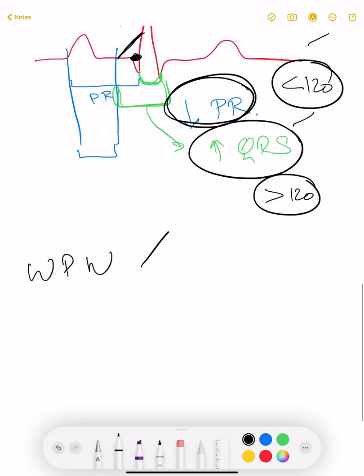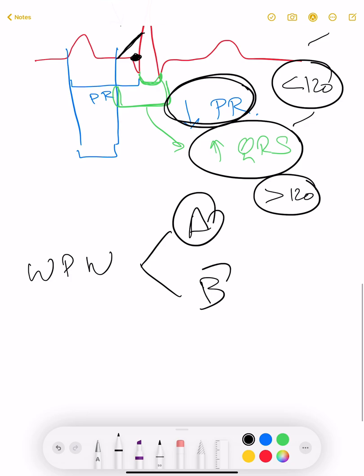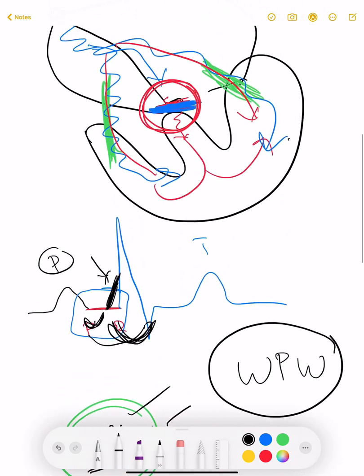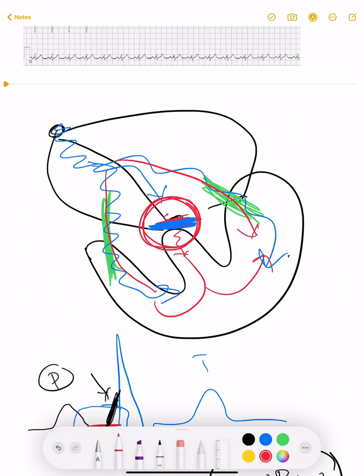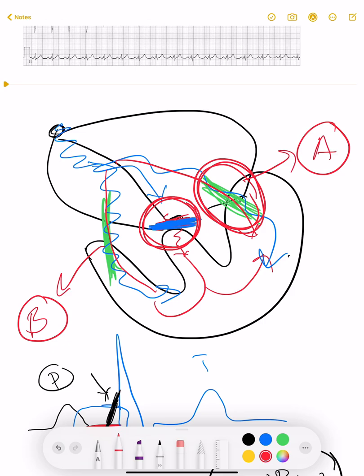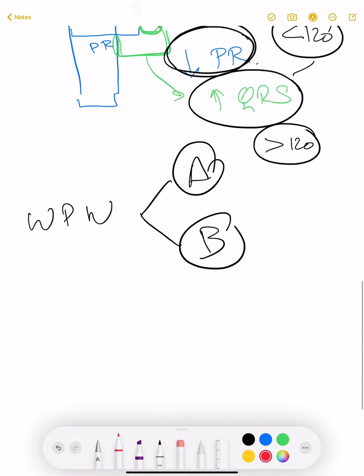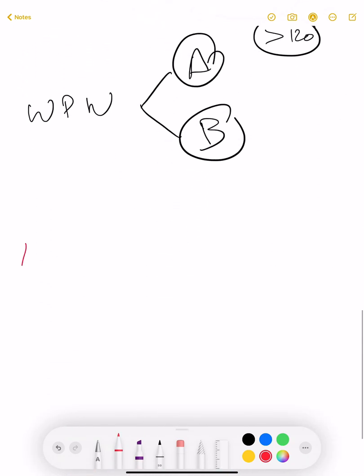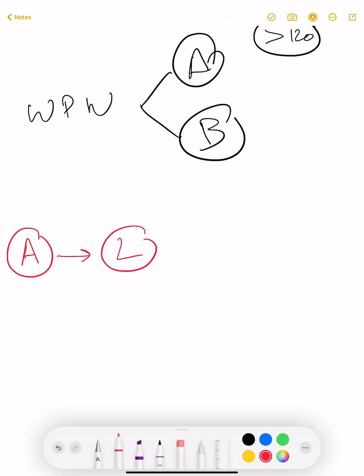WPW syndrome can be Type A or Type B. As I mentioned, the pre-excitation pathway can be on either side of the heart. If that pre-excitation pathway is on the left side, it will be called Type A WPW syndrome. If it is on the right side, it will be called Type B WPW syndrome. Anatomically, Type A is on the left side and Type B is on the right side.